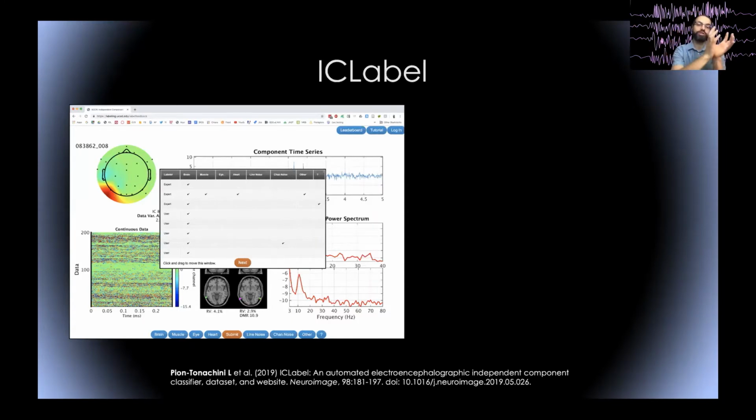So there's a section where you learn about recognizing these components, and there's a section where you label these components. And so you had this contest, you could win an iPad, sorry, it's now over, so you can't join the contest anymore, about who would label the most components. So you had a total of 15,000 components labeled by experts.